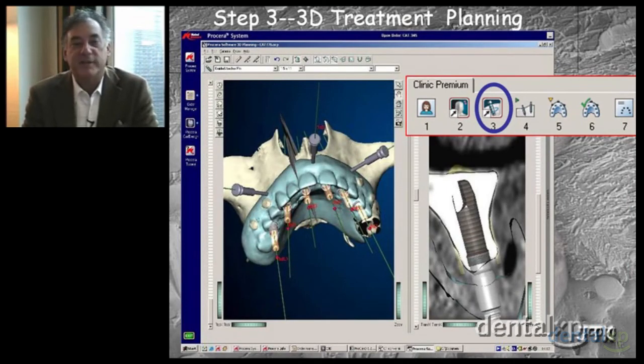Now the information is sent over to us for our planning software steps. This can be transmitted through the internet, through a jump drive, through a key, or through CD disks. For example, if we get it on a disk, we would load it into the software and we would open up the D drive, enter it into the software, convert that data, and place it into the software planning itself. These images are of step 3.